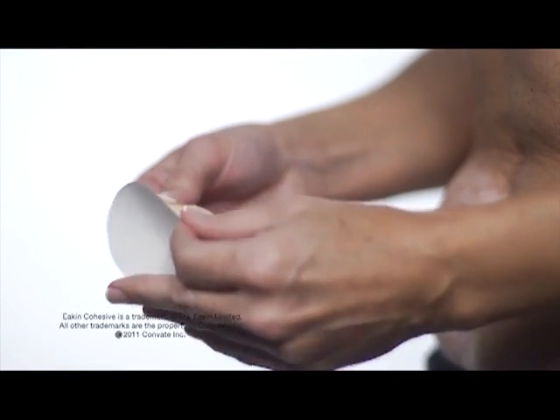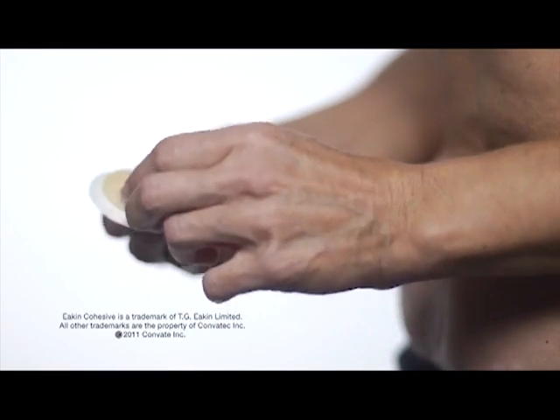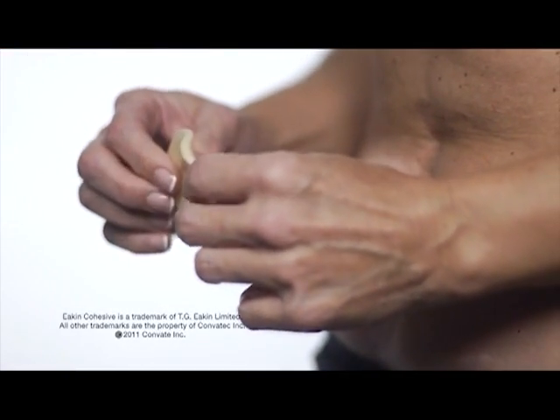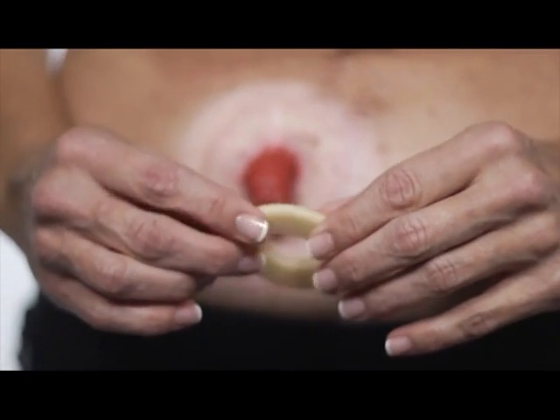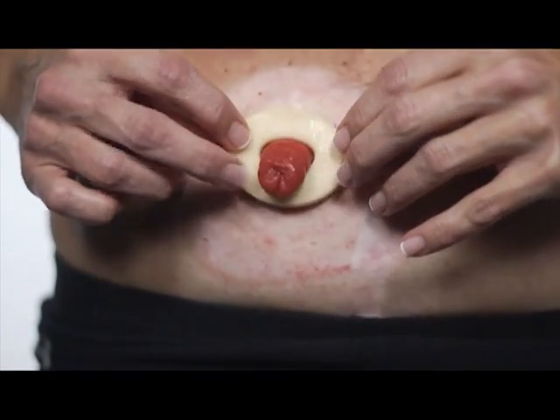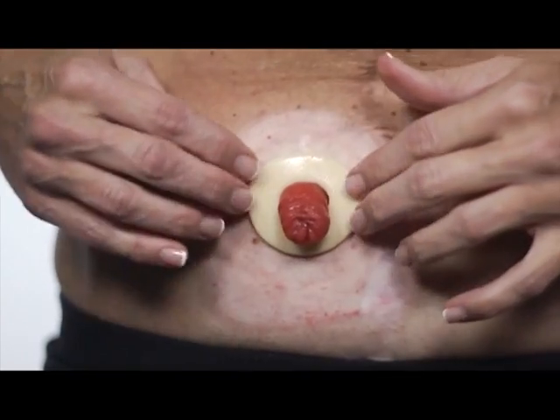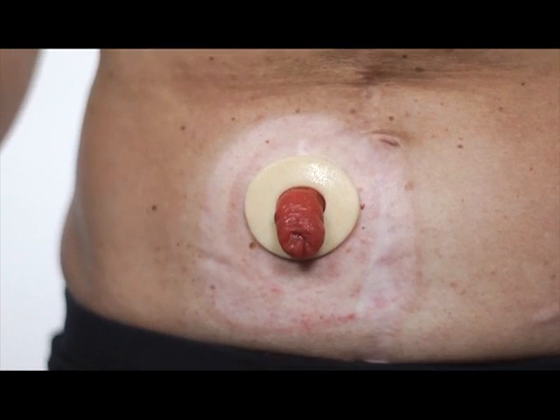Your healthcare provider may have recommended Cohesive seals to help fill in uneven areas around your stoma to prevent leakage and to protect your skin. To apply, make sure the skin is clean. Remove the release paper from both sides of the seal. Shape or stretch to the size of your stoma. Then, place the seal on your body and carefully mold it. You want the fit to be snug around your stoma. Then continue applying your wafer and pouch.